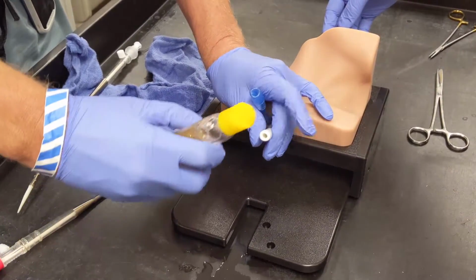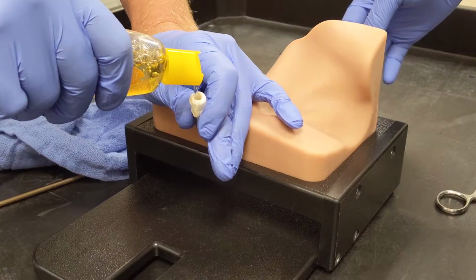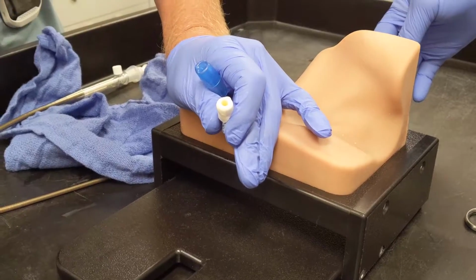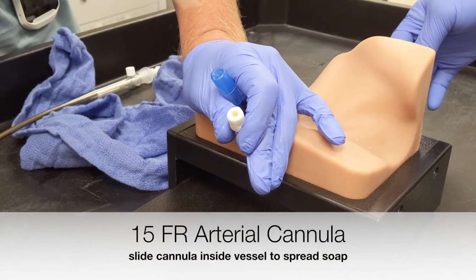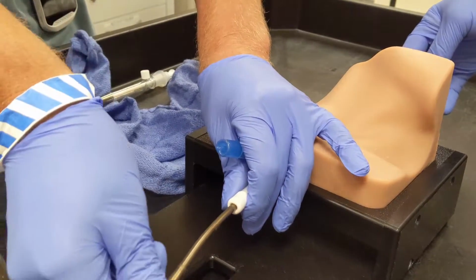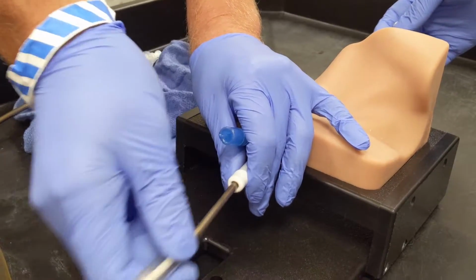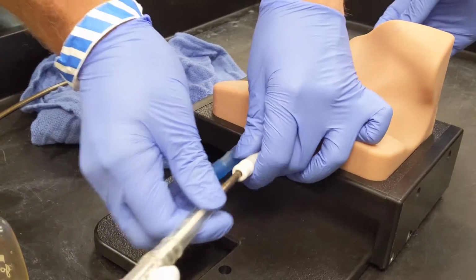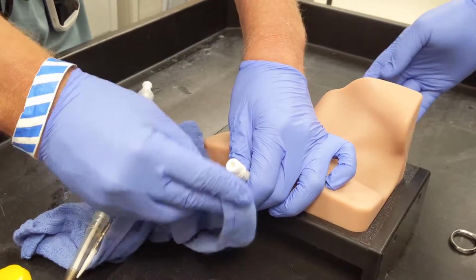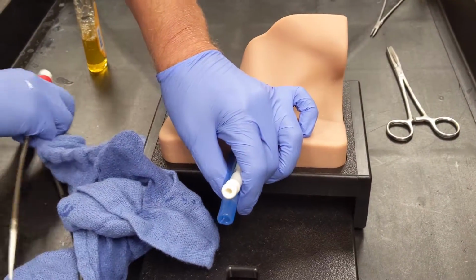And then we do the same thing for the carotid. This one slides a little easier, so you don't need as much soap. And when you do it, you know, flatten it out and slide it in. Okay, so make it level when you're sliding it. Okay, so then we're good. So the next step is we connect to the heart, and then put the cannulas off to the side.